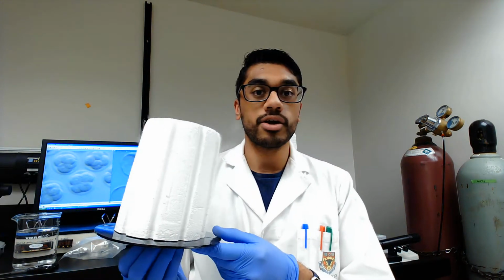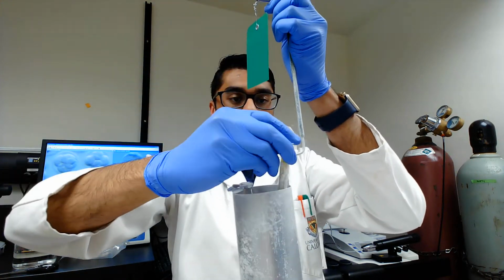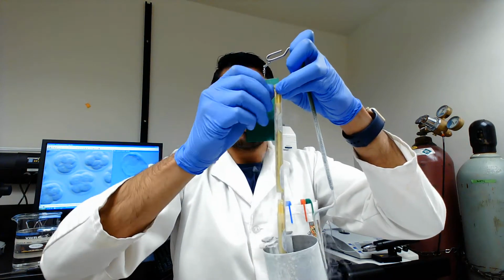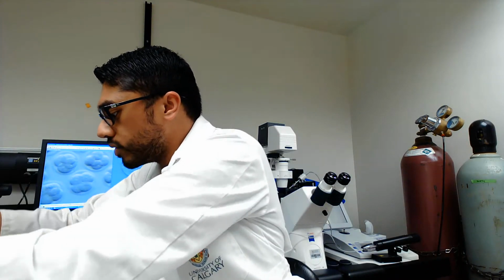Now for sperm, it's really cool because in our lab, we have a bunch of cryopreserved sperm, millions and millions of doses of bull semen here. Here's an example. We have some straws within these canisters, and all we do is thaw one of these straws within some water. I'll just do one right now. Put that there, and we'll let that thaw, and I'll show you guys what the end product looks like.